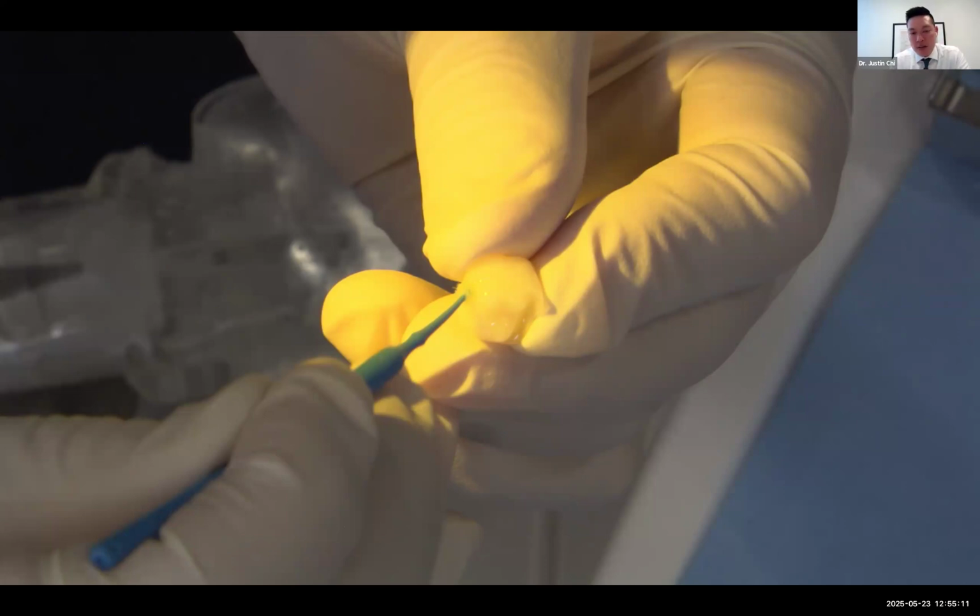Otherwise, if you're just looking for matte surfaces or just basing it on passage over a certain zone, it's a little bit unreliable at best. So I like sandblasting away the color. Once we sandblast away, we're going to rinse and clean any excess residual aluminum oxide that might remain, just so you have a clean surface, and dry it.